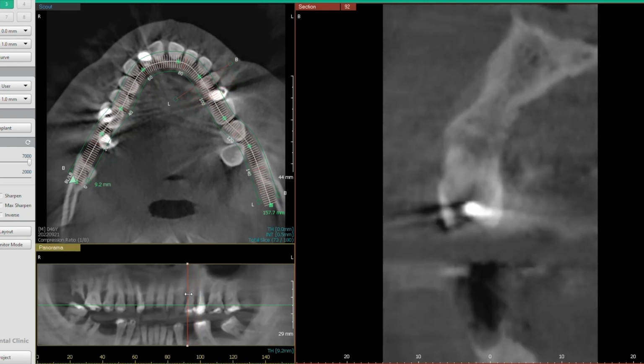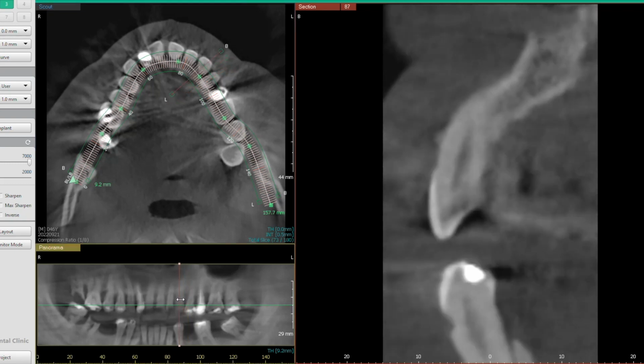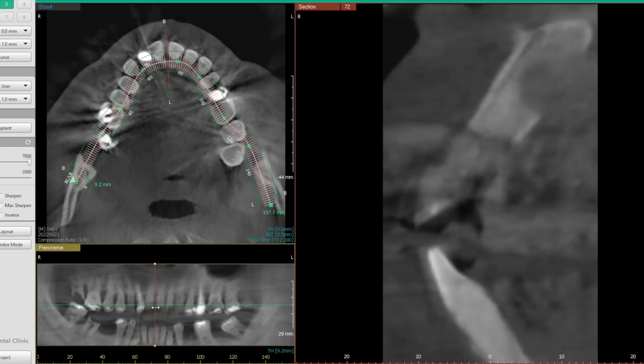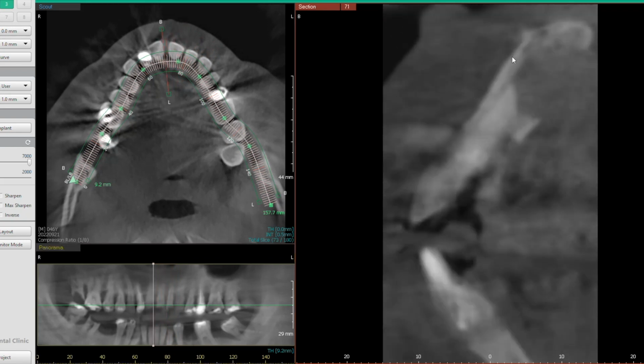Let's take a look at the adjacent teeth. Same thing. Roots. And then you got the bone. Again, this is the outer lip, nose, roof of the mouth. Okay? So we're looking at him from the side. So we go here. Same thing. Go over here. And then, whoa, wait a second. What's all that dark? Go from here. Oh, what's all this, right?